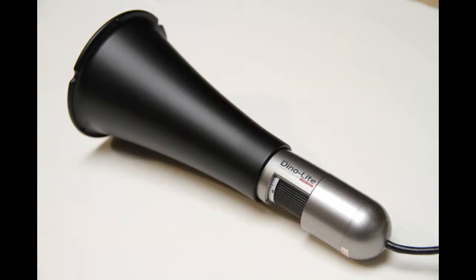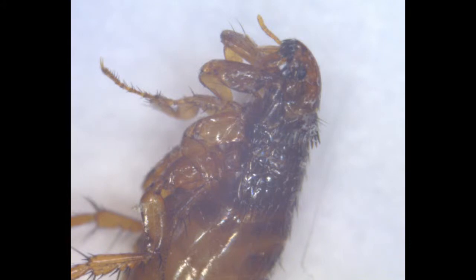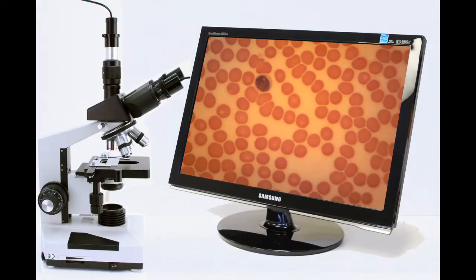With the help of our multipurpose cone attachment, the ADL series becomes a dermatoscope, easily parting through hair and exposing bare skin, allowing for inspection of ringworm, parasites, lesions, and infection. Parasites can easily be detected on the skin, removed, and then examined.